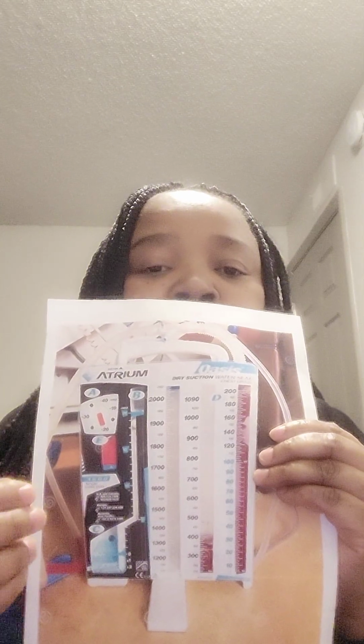Then if this unit is knocked over, if maybe somebody kicked it, or you are trying to move things from the side of the patient's bed and you accidentally push it, what you should do is change this. And there are times when somebody, maybe a patient relation or somebody else walking inside the patient's room, may come in and accidentally kick it and put it back up.